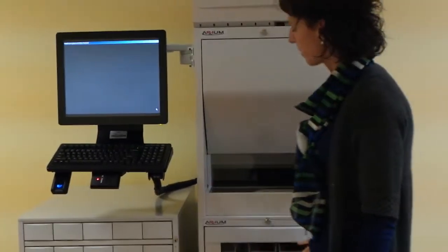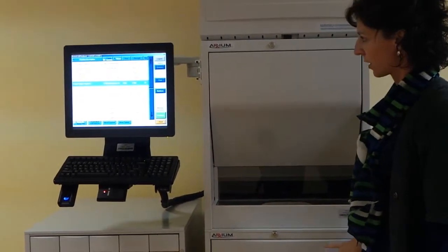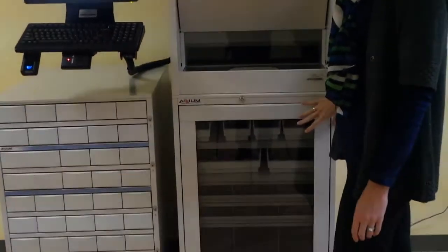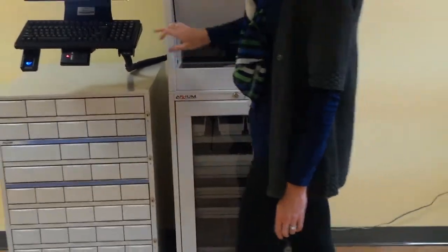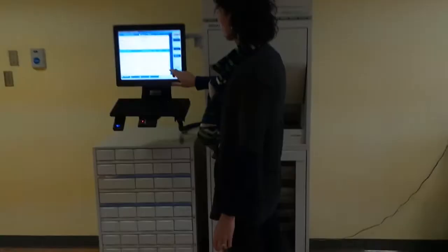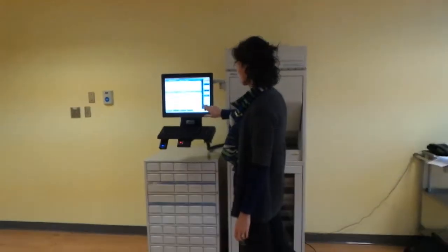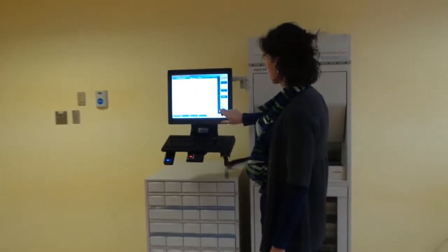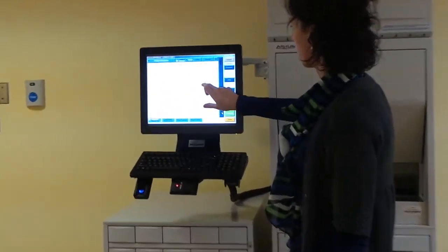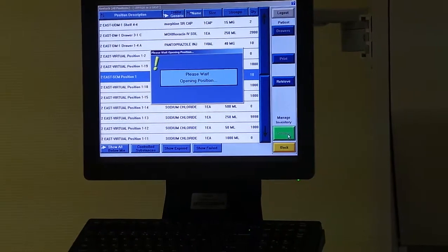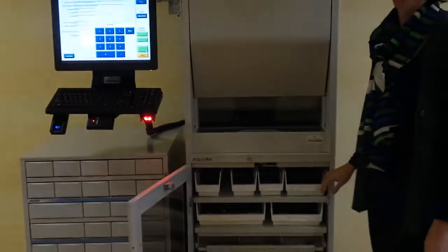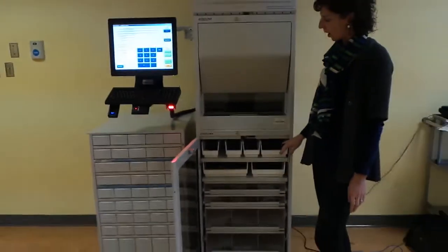The final piece of hardware on these stations is a supply cabinet module. What will happen is if you're dispensing a medication that is stored in the supply cabinet, the entire door will open.